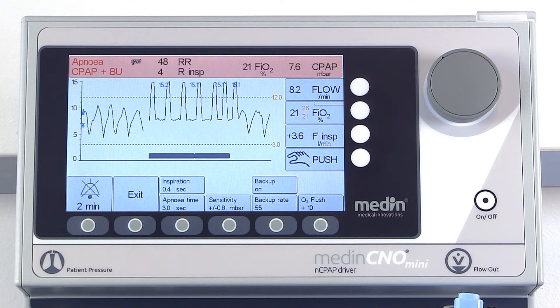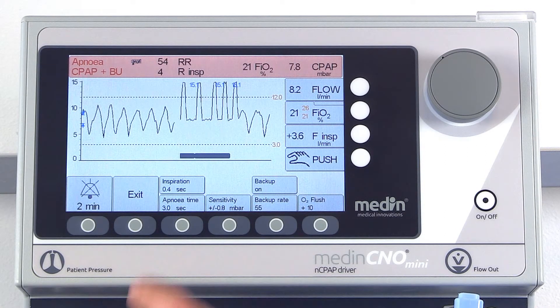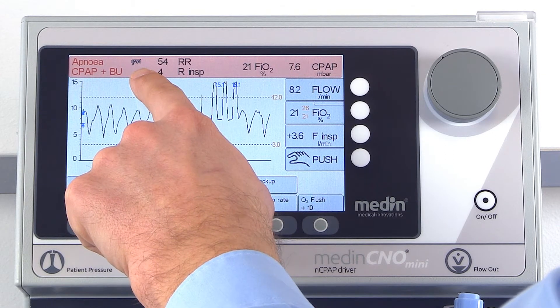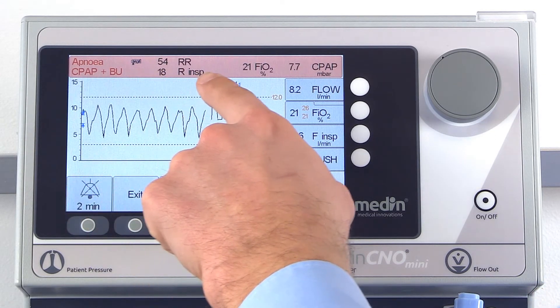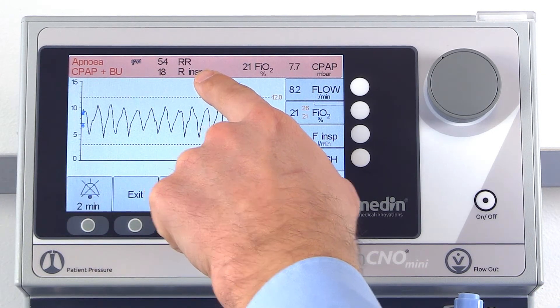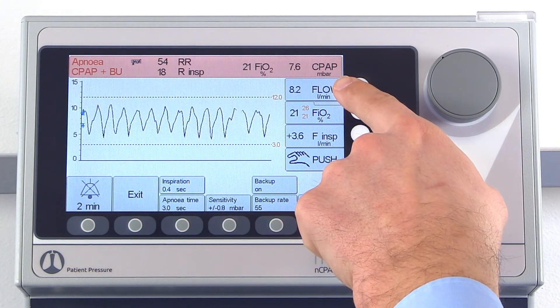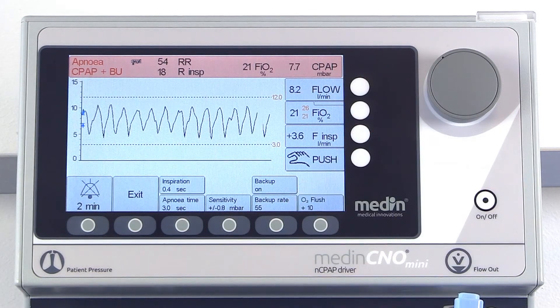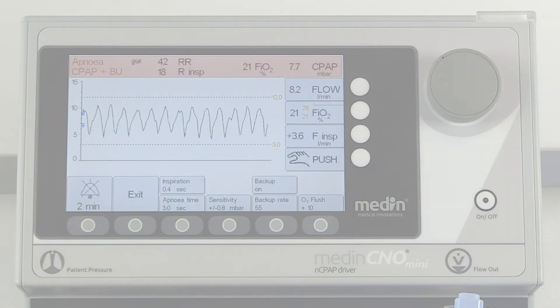The display also provides information about battery status, respiratory rate, and NCPAP pressure.